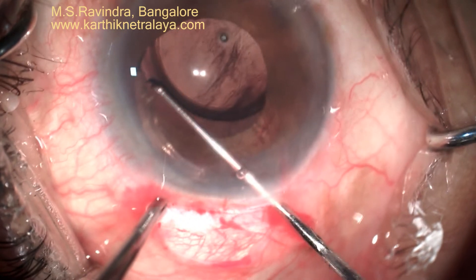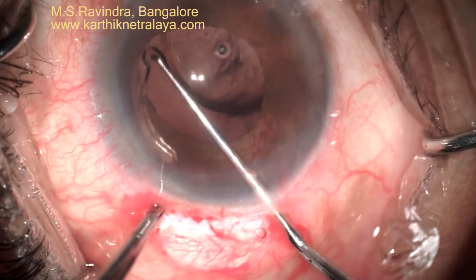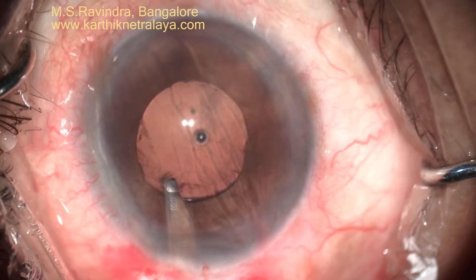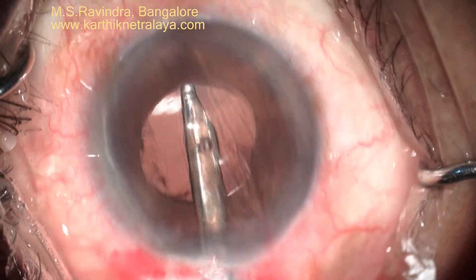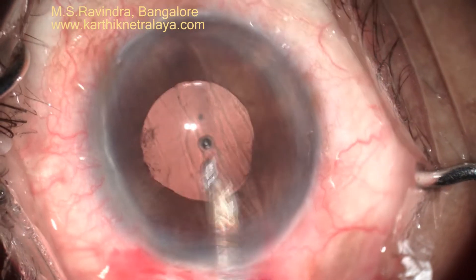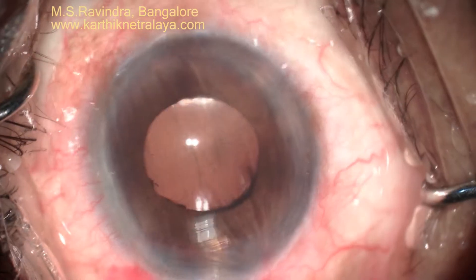The system visually monitors and aspirates all debris from the anterior chamber and viscoelastic from behind the lens, from the anterior chamber, and from the lens surface and the back of the cornea.